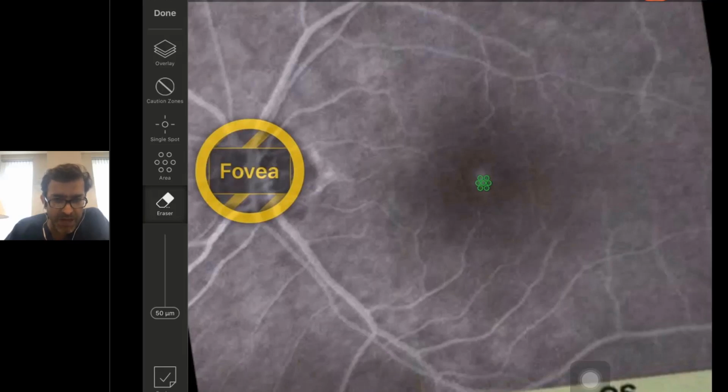Okay, so before we really end, I would again re-emphasize that I'm doing a subfoveal laser, which is 5% duty cycle with the confluent burns. So before you really press the foot pedal, make sure that your duty cycle is at the lowest, that is 5%, because you understand that you are hitting the fovea with this laser.